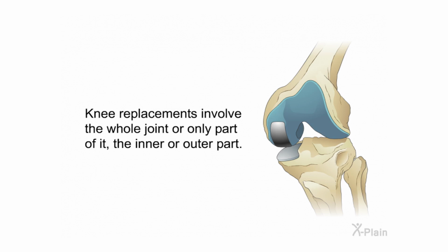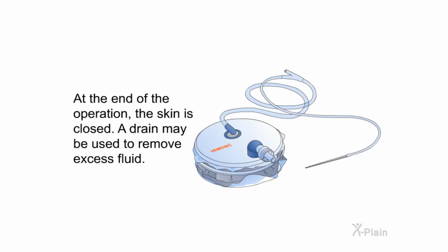Knee replacements involve the whole joint or only part of it, the inner or outer part. At the end of the operation, the skin is closed. A drain may be used to remove excess fluid.